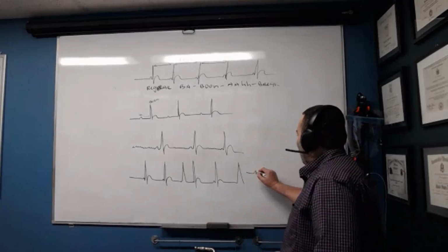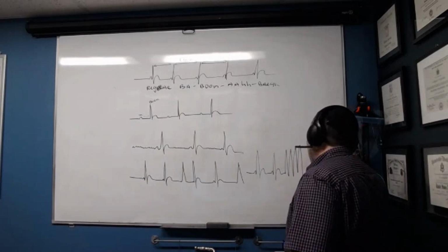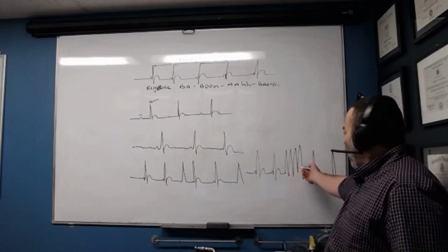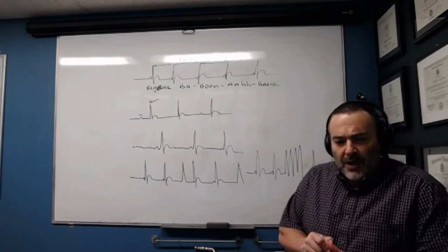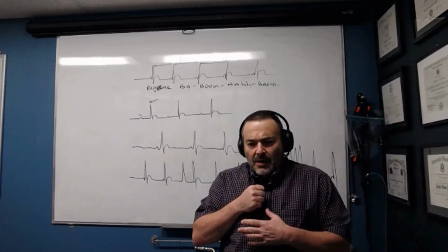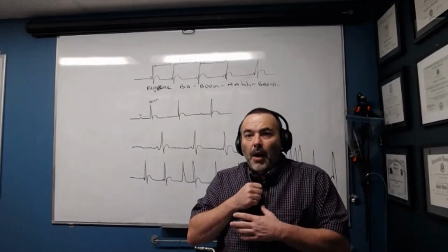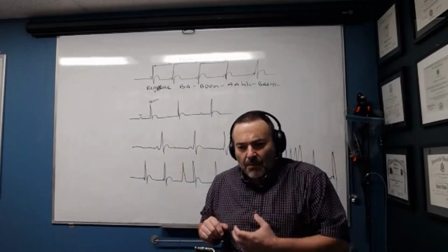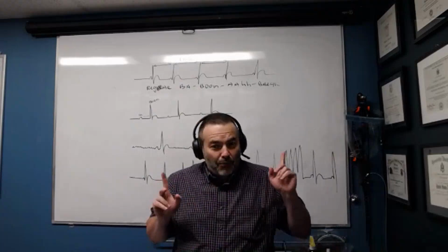And all of a sudden, you can go with your ba boom, ba boom, and then you got boom, boom, boom, boom. And then you go back again, ba boom, ba boom. What? Four extra booms? We don't like that. Instead of going ba boom, ah, break, we go ba boom, ah, break, boom, boom, boom, boom. Oh, hold the phone. Extra beats on the bottom. No, no, no. It's supposed to be ba boom, ah, break.